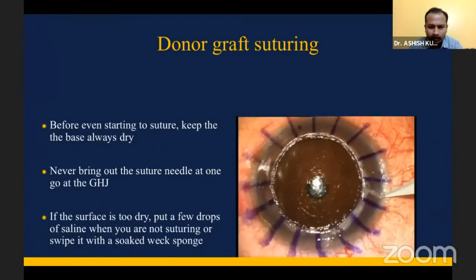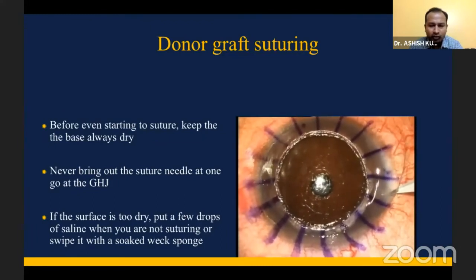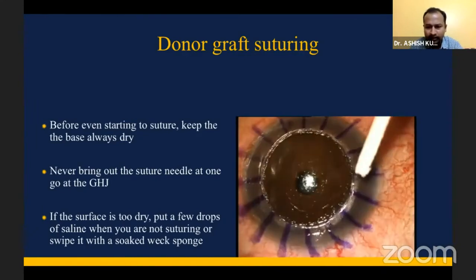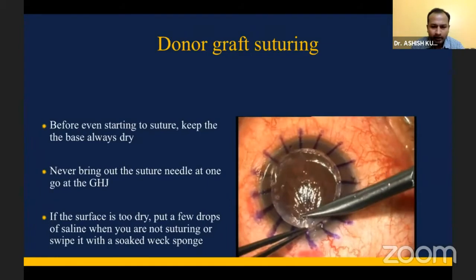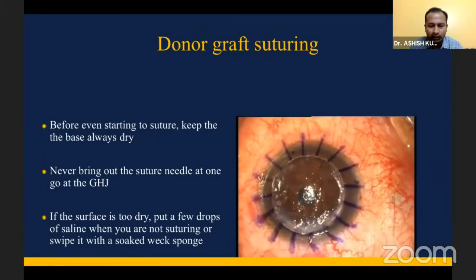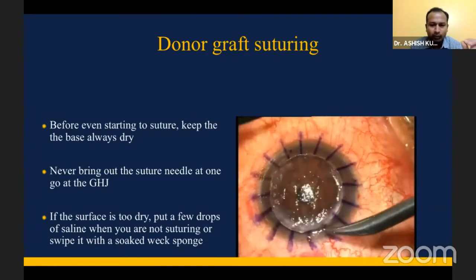Now, coming to suturing. Even before you start suturing, make sure that the surface, the area, is dry. Here I'm trying to decompress and then I'm drying it. The reason I'm keeping it dry is that if you have a perforation at any time, aqueous will leak, and if it is dry, you'll be able to note it. But if it is wet, then you'll not be able to.